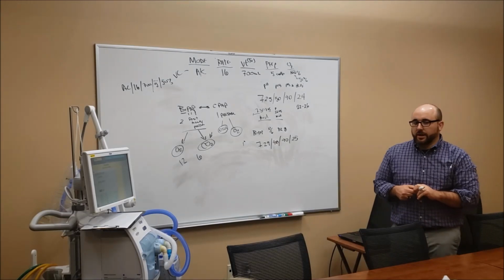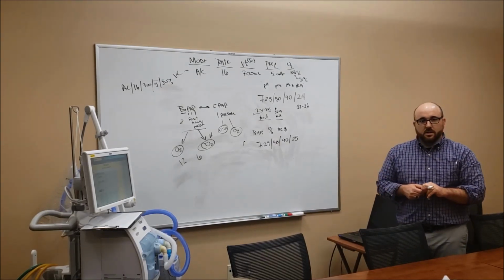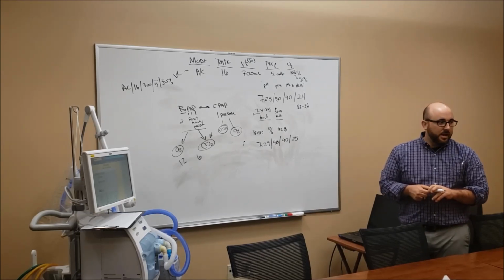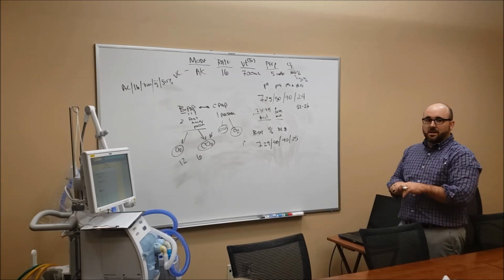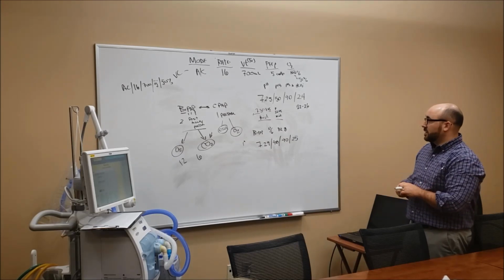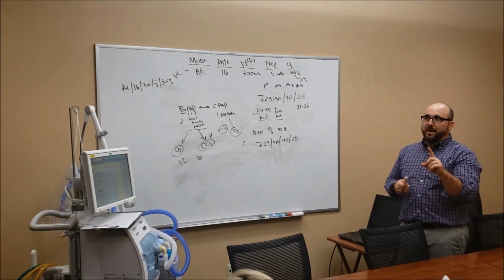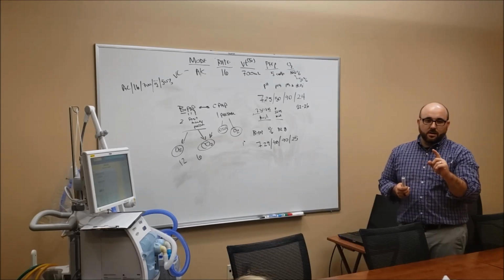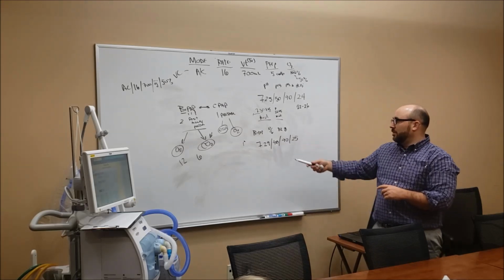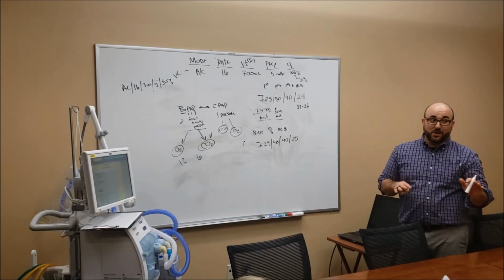This blood gas is 1 hour later. Is it within normal limits? No. Acidosis or alkalosis? Acidosis still. What's causing it? Respiratory. So here's your question: is BiPAP working? Minimally. That's an hour later, and I'm not really super happy about that. But we are showing a decrease in CO2, which is really good.